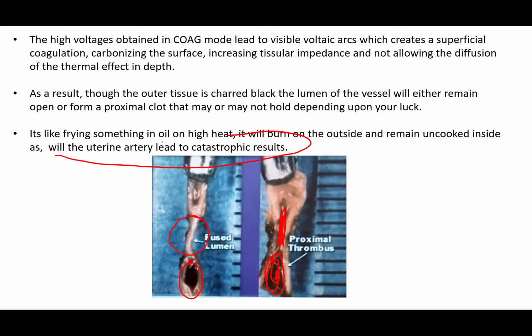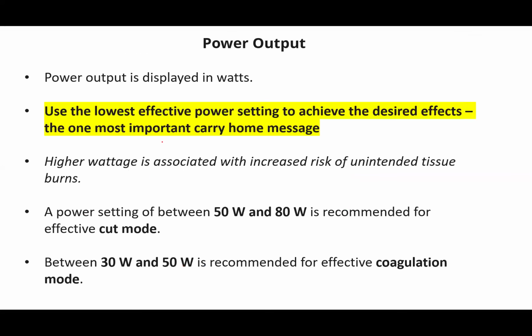And for the uterine arteries, bigger arteries like that, you have to see some bubbling around the artery before you release. But you will see more modern equipment that has a feedback that will sound an alarm to tell you that there is complete sealing of a vessel.